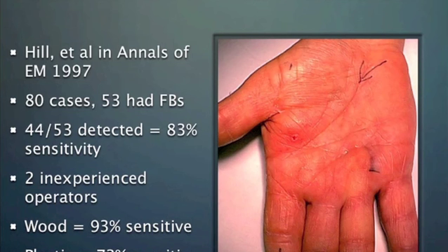And this was a case of a patient who came in who said they fell on an outstretched hand onto a toothpick, and this was the site of entry of the toothpick. And with ultrasound, the toothpick was actually located way over here. And before using ultrasound, if I was even able to see a toothpick on x-ray, I would have really been lured into opening up this area, searching around for a foreign body. However, the ultrasound is very successful in localizing it where it needed to be, which was where the toothpick wound up. This is what it looked like on ultrasound.